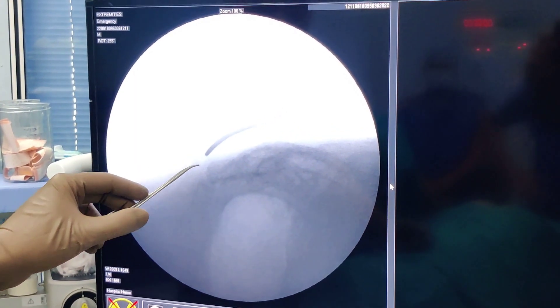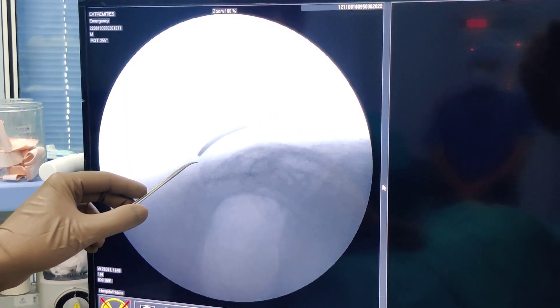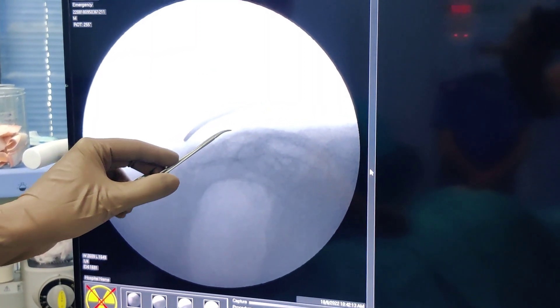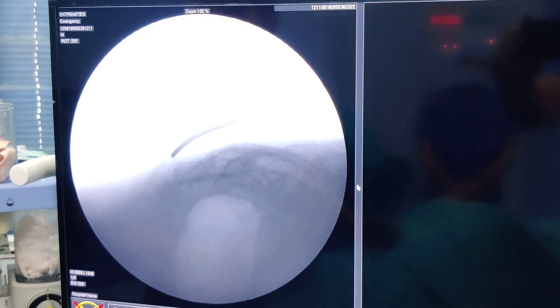Looking at this image, this is the prominent bit that you will feel — that is the cornua — and this is the sacral hiatus. This is the area which we are going to anesthetize.